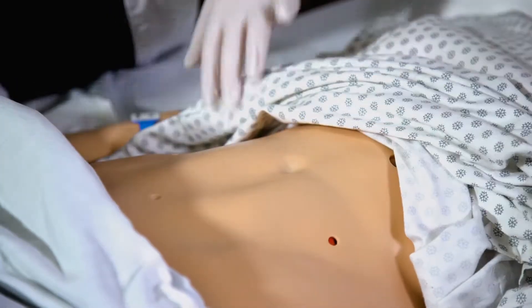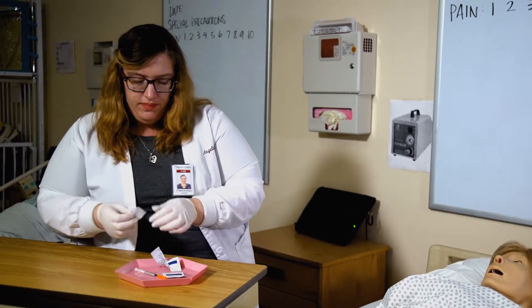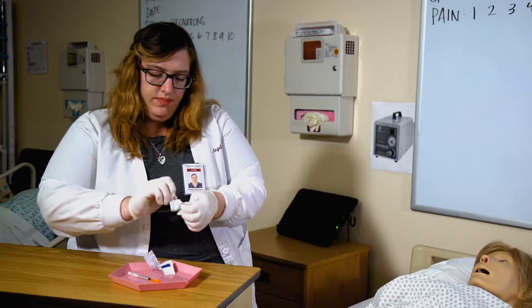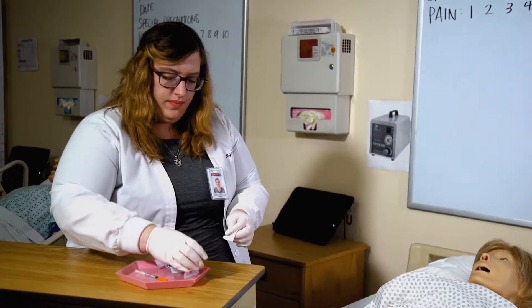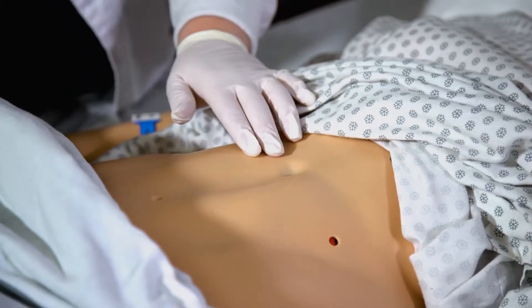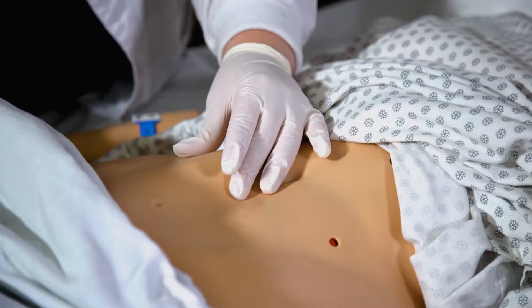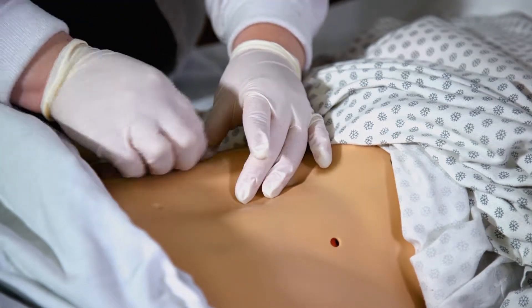Use subcutaneous tissue around the abdomen, lateral aspects of the upper arm or thigh, or scapula area. Be sure to avoid the belly button and about one to two inches around the navel area. Use an alcohol pad antiseptic swab to clean the skin at the site.